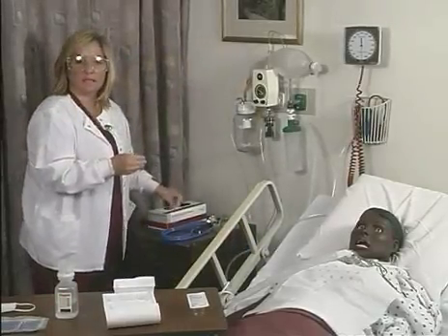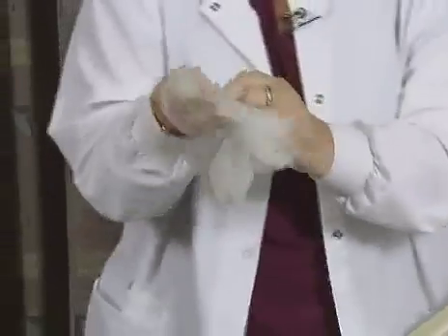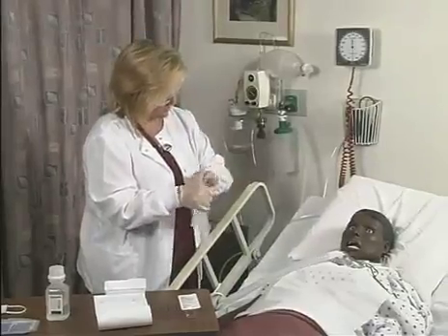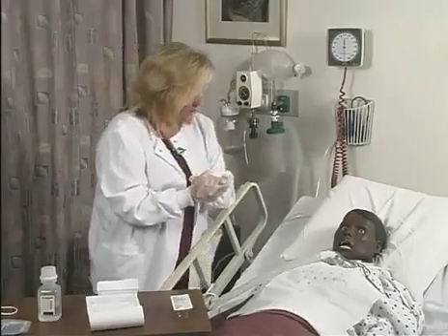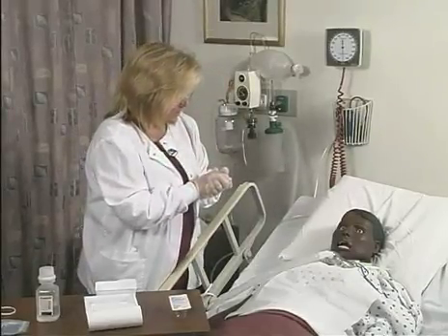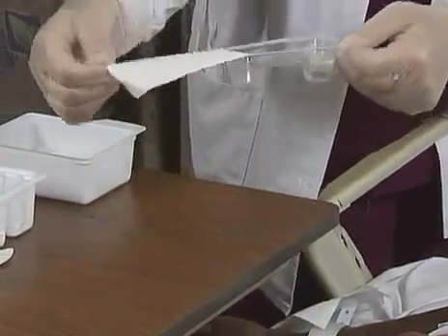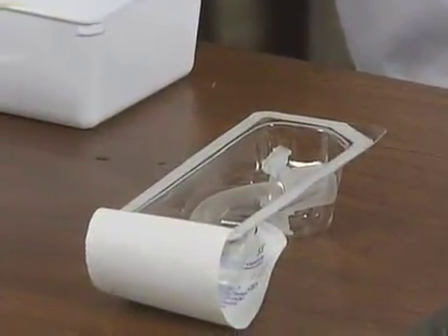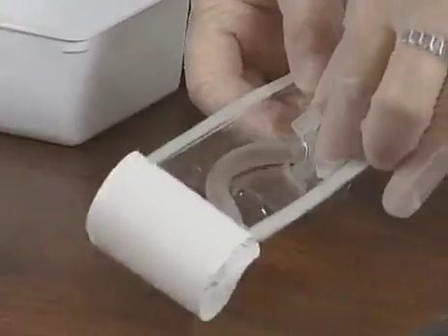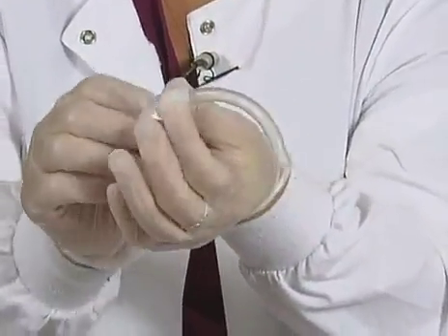I'm going to put on some non-sterile gloves. How are you doing, Mrs. Jones? You did very well with the suctioning procedure. Now I'm going to insert a new inner cannula and change the gauze around the tracheostomy tube. It's important when you insert the new inner cannula that the distal portion remains sterile. This portion being the distal portion, and the upper part does not need to remain sterile.